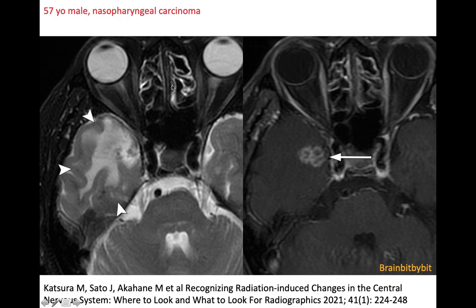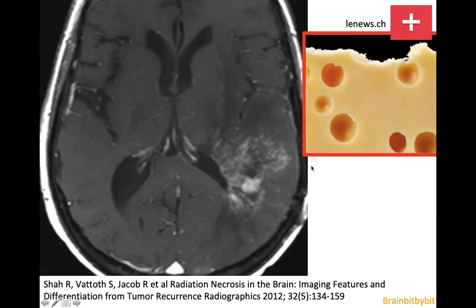This is a 57-year-old patient who had been irradiated because of a nasopharyngeal carcinoma, with radiation necrosis in the right temporal lobe. Radiation necrosis typically has irregular enhancement with a so-called Swiss cheese pattern, where the holes in the cheese are the non-enhancing necrotic parts of tissue. It has also been described as a soap bubble appearance or a spreading wave front.